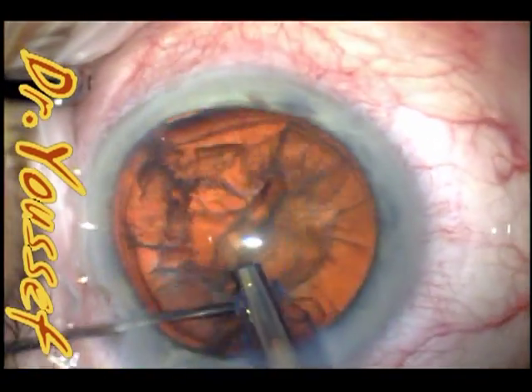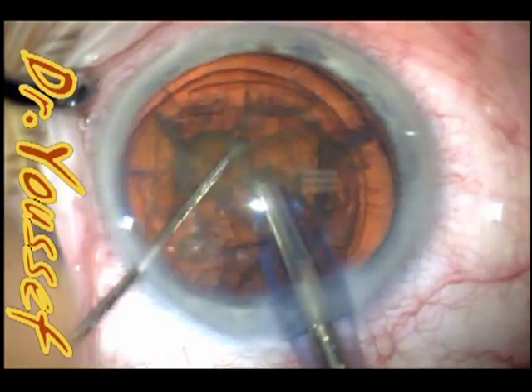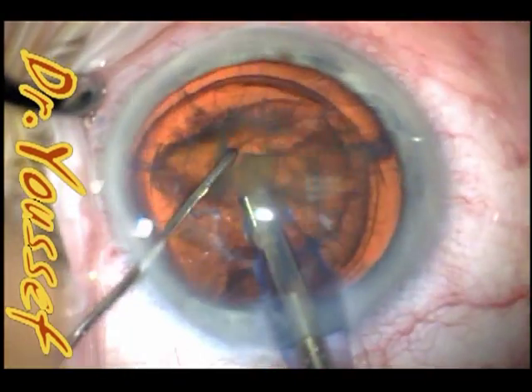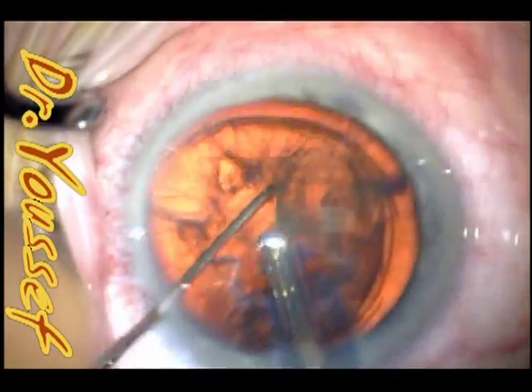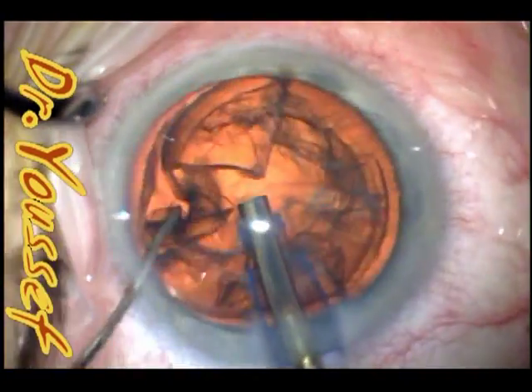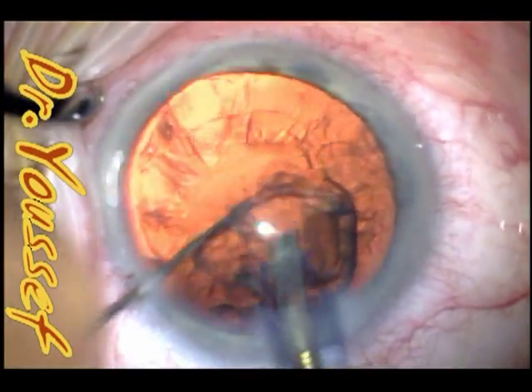You can see it's coming off really easily — it's not a difficult cataract at all. We divide the nucleus into four quadrants, and each quadrant is divided into two when it's time to remove it. This is the epinucleus — completely gone.